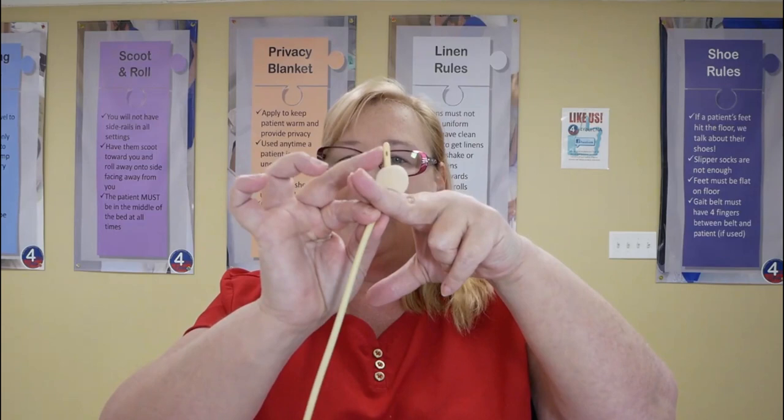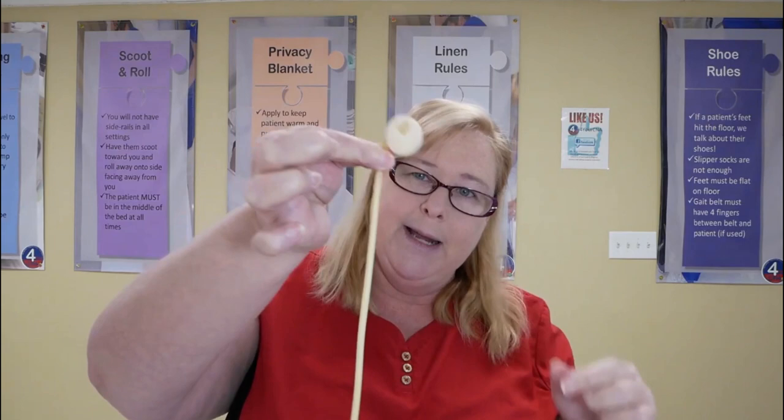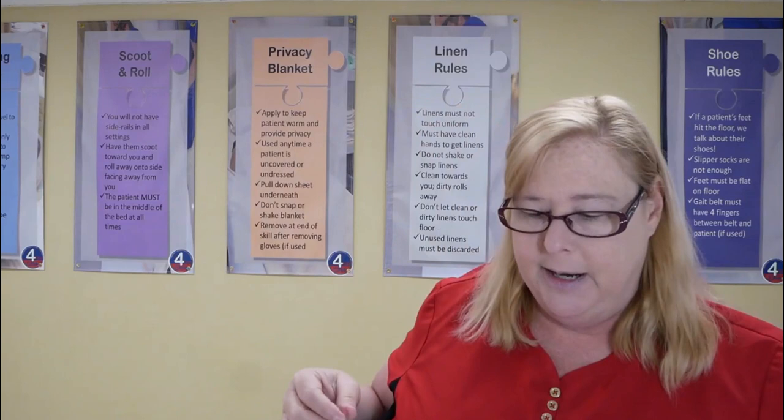You want to try to hold this in place so that as you're wiping away, this part in here remains stationary. So we're going to hold this where it exits the body and then wipe away. Super important that you're holding it stationary before you wipe it. But that brings up a question. What do we do if it does come out?